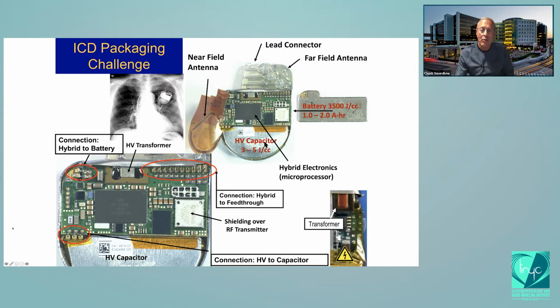The key point is that storing electricity at high voltage is much less efficient than storing chemical energy at low voltage.